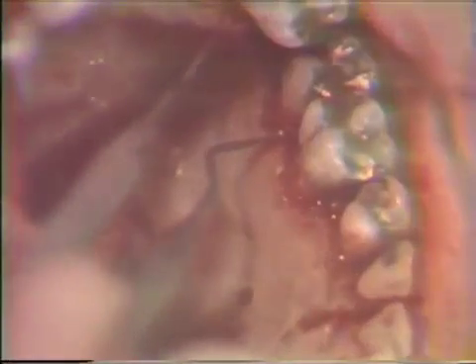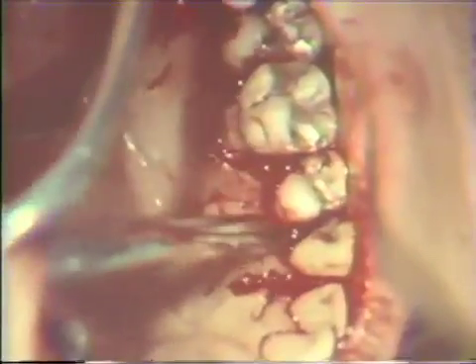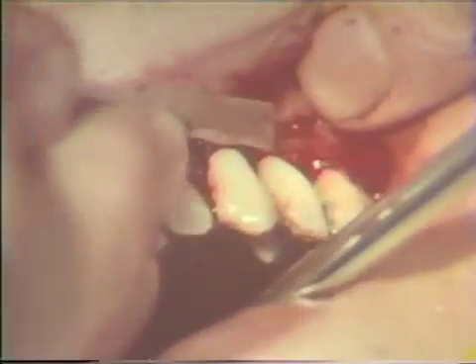The palatal flap is reflected to show the alveolar crest and the interproximal areas. A tag of interproximal soft tissue can be observed between the first molar and the bicuspid; this tissue is excised with an Orban knife. A number 17 explorer is used to check the smoothness of the root surfaces and the beginning trifurcation involvement on the first molar. This area should be well cleaned out. The wound is inspected for any residual tags of soft tissue, calculus, or softened tooth structure. A bone chisel is used to remove a protruding ledge of the alveolar process on the buccal side. This sharp ledge would interfere with good flap adaptation following surgery. Only the protruding part is removed.